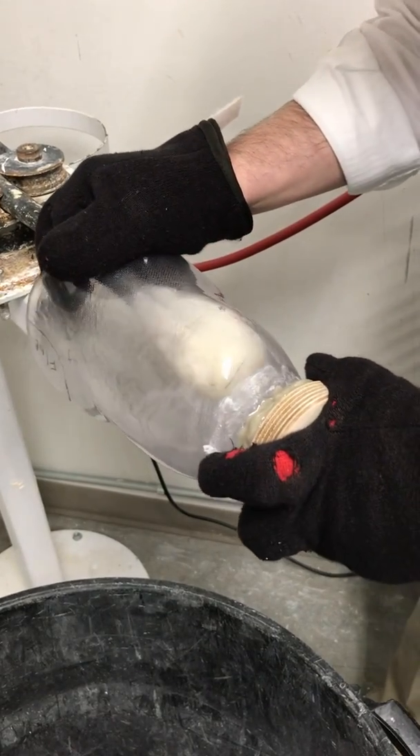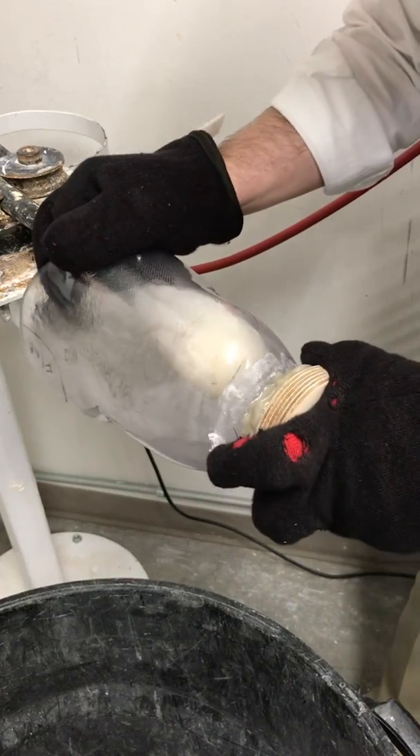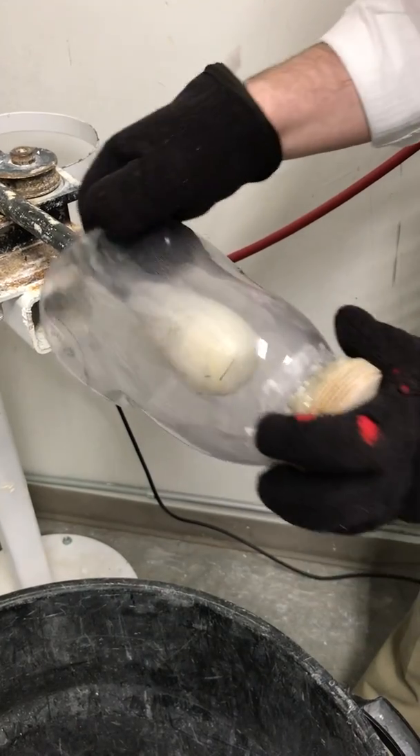This is most commonly used for relieving the anterior distal tibia of a BK. We will also sometimes relieve the fib head of a BK. Those are the two most common spots.